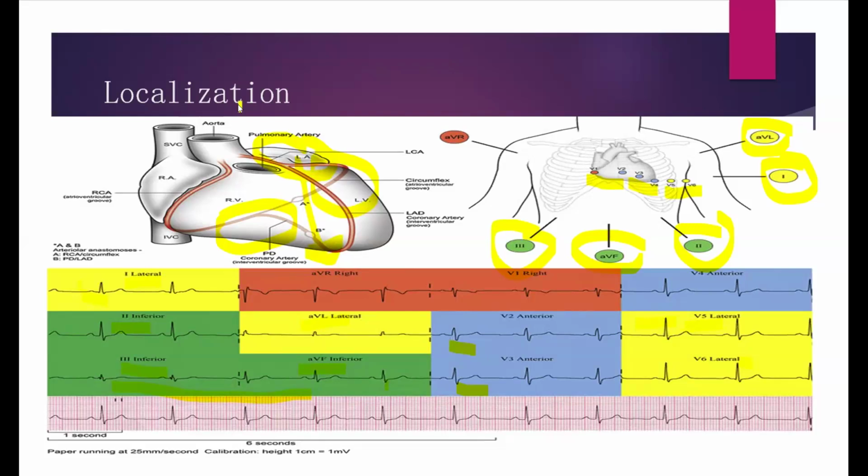Is that okay? I see we can take just the last 2 questions that I see in the chat box. The first asks, how do we define a ventricular hypertrophy in ECG? And the second is clarifying the concept of the concave and convex STEMI morphology.